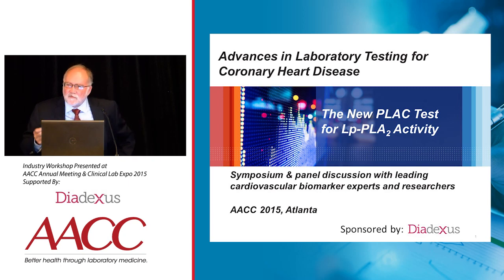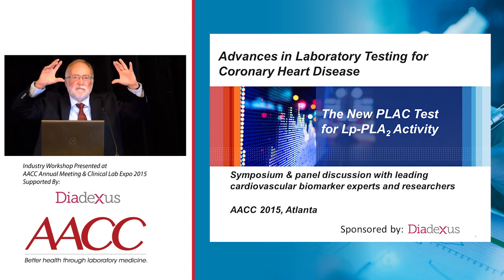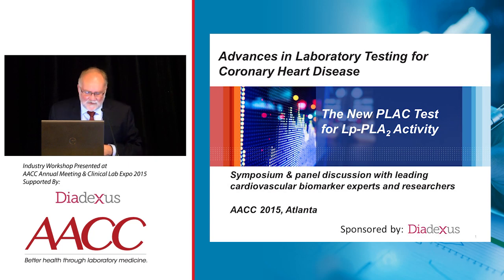There are probably others, but two major ways. One is as a mass assay. And what a mass assay does is we know that all enzymes are proteins. So during a mass assay, we treat the enzyme as if it's a protein, okay? So we have immunoassays that we can develop. We developed antibodies to Lp(PLA2) and can measure it in what's called mass units.